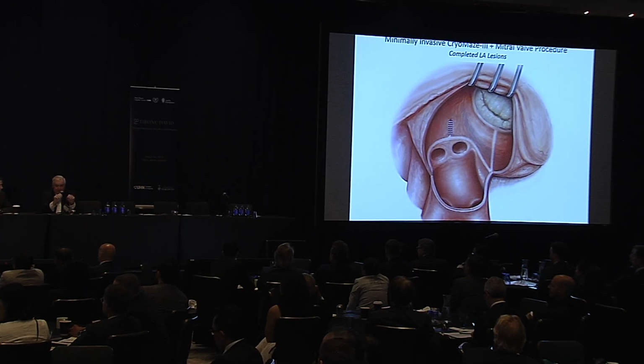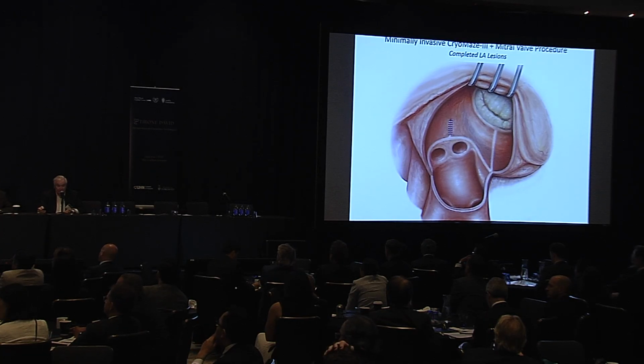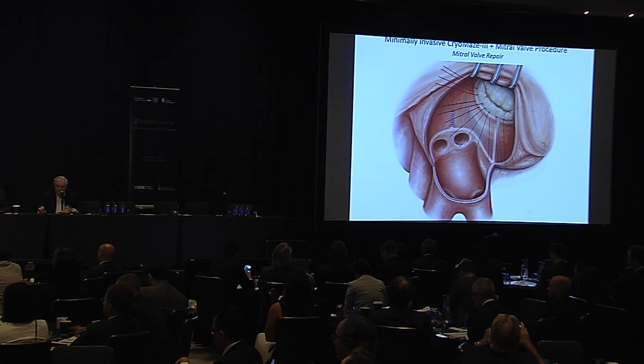What you do is put a couple of Kittners inside the orifice of the left atrial appendage and start doing it like this. There it is. So now you've got the corners, and that's how you close it from the inside. And at least in our experience, it won't come open. We did the first 300 or so maze procedures. No, we did the second 300 or so maze procedures, the cryo maze procedure. We always closed it from the inside like this. I've had one that caused a problem.